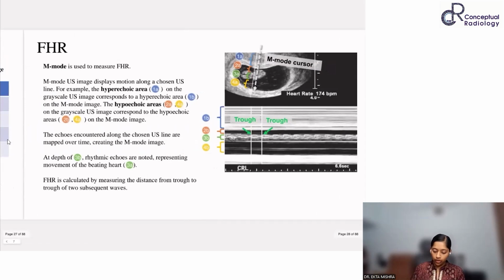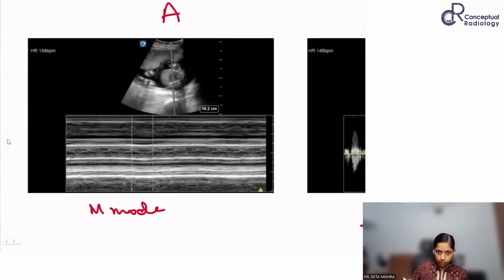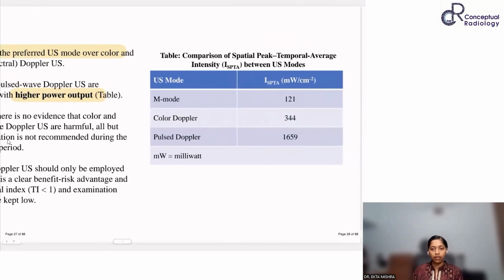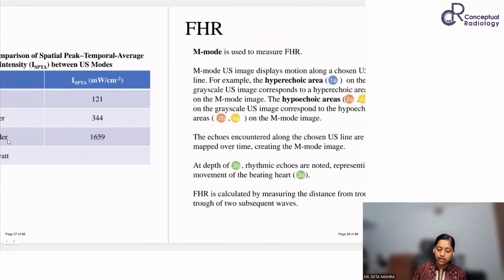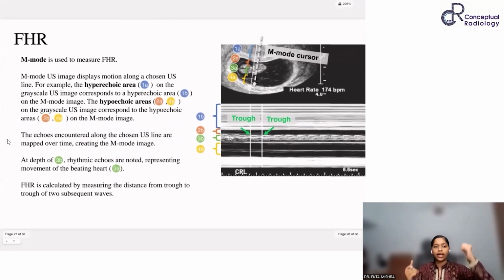So are you aware what represents what in M mode? Where do we measure, and why am I measuring at this point? When you are a beginner, it is difficult to use M mode to detect heart rate unless the heart rate is very brisk and you get nice lines. What if it is feeble? Then it's a little tricky, and these images will help you read the M mode. So keep focusing on the image.